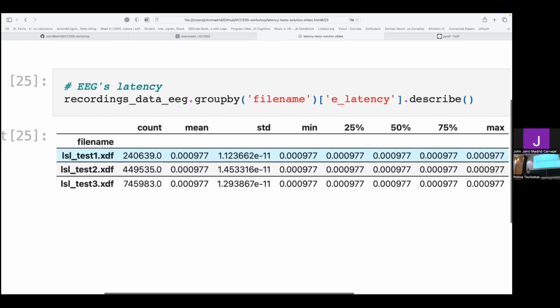Yeah, so as I said before, people use the word latency simply to describe the time it takes for samples to travel from A to B, and simply the distance between those samples in time.